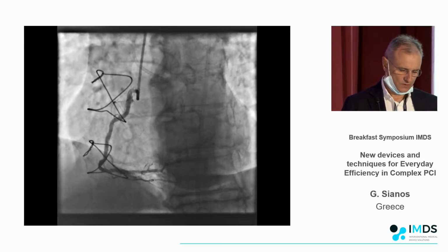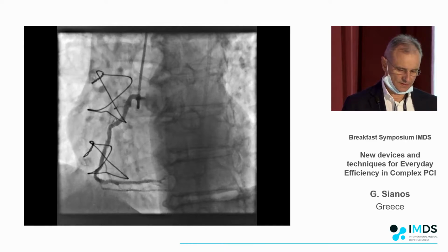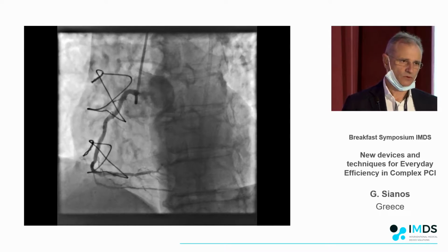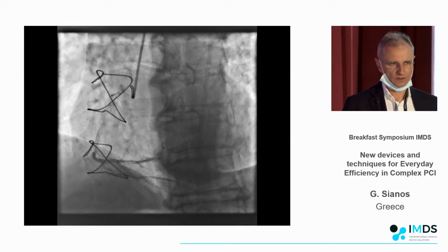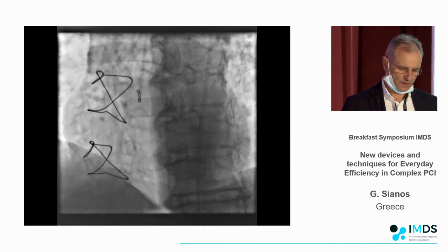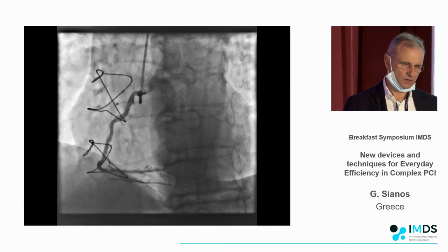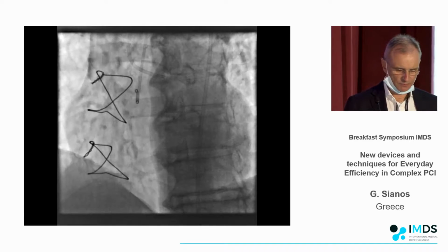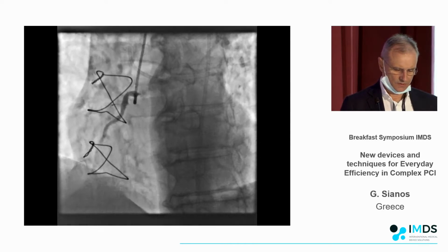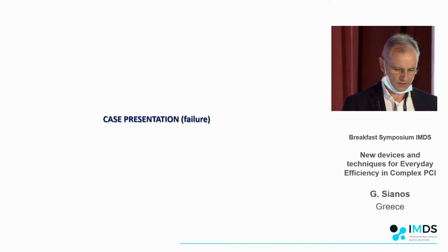big. So one of the things that makes it difficult for the presentation, you have to be focused, and one of the things that someone has to care about is when you're loading the device. You have to get used to that, because the monorail is so short that sometimes people are pushing in a way that they're destroying the device. So it's a device that needs some training.